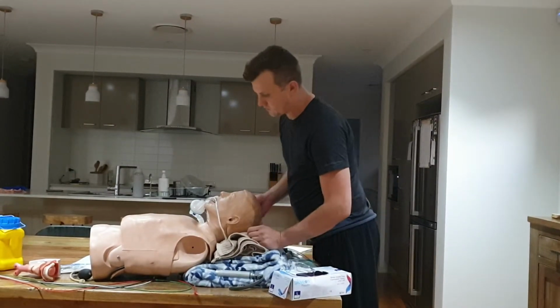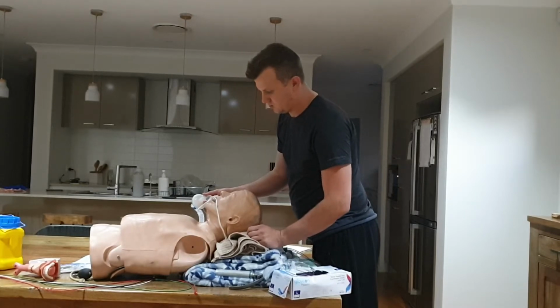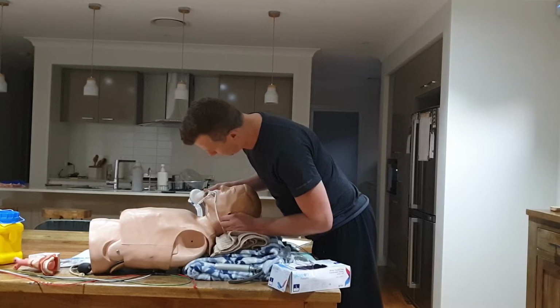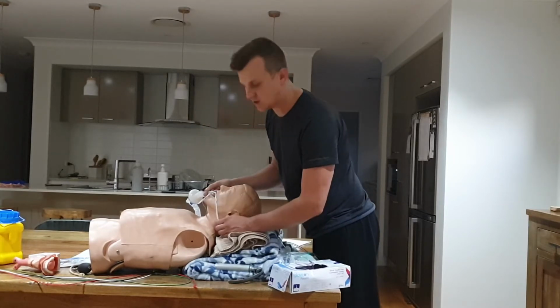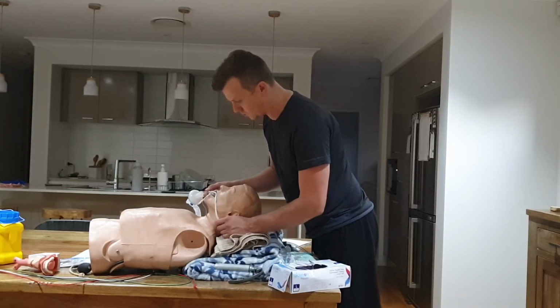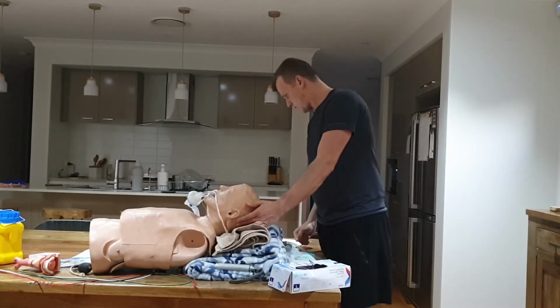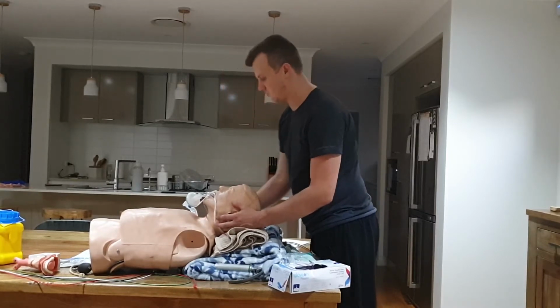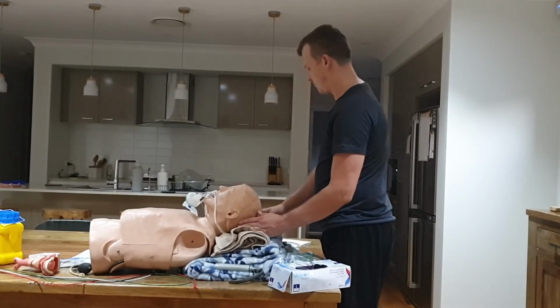Now with documentation for the tube, you want to document what size tube you used. Also, if you look at the side of the tube, it has markings there. And then you just want to mark either at the lips or at the teeth what centimetres the tube was placed at, and that you visualised it passing the cords. The other thing is how many attempts were made, if there was any cricoid pressure required, or any complications that may have arisen from it.